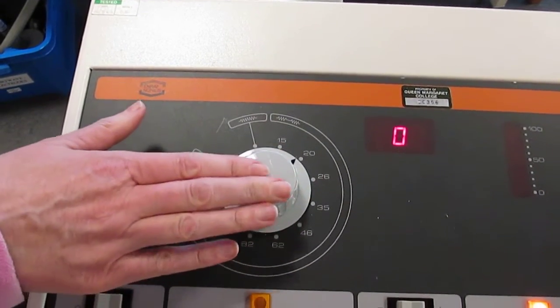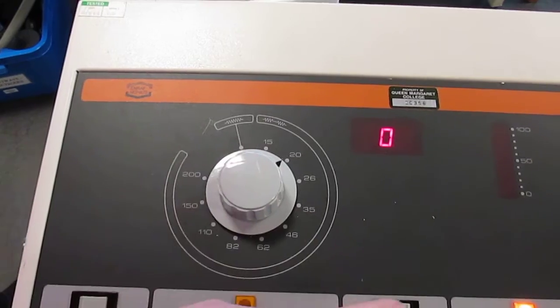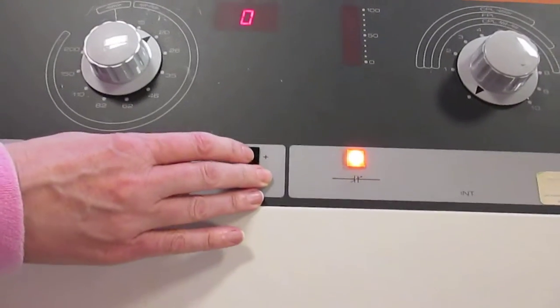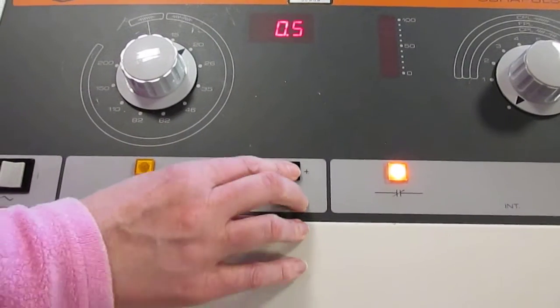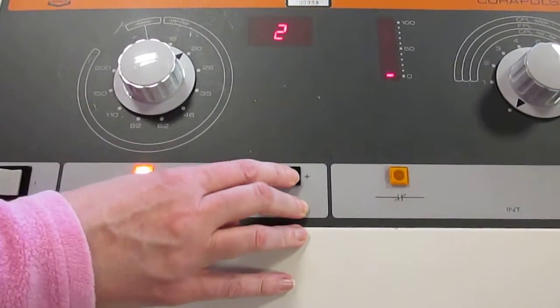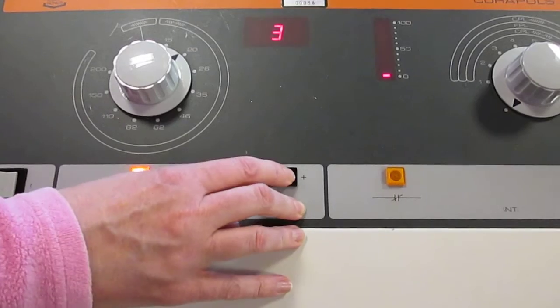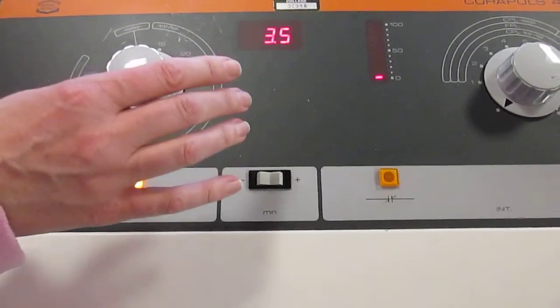Once you've chosen your pulse repetition rate, you're then going to set the time that you want to treat your lesion for. You push the plus button to add, and it adds 30 seconds at a time.